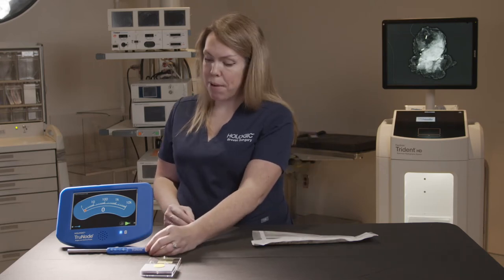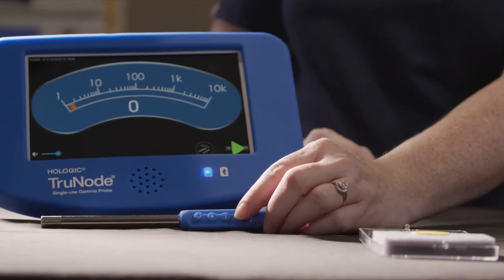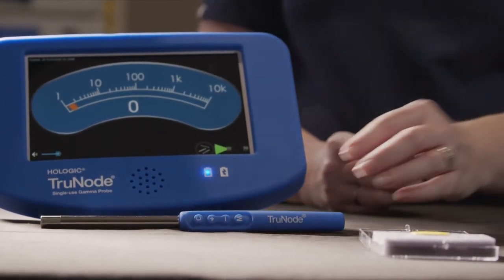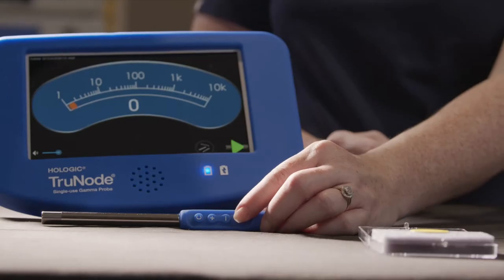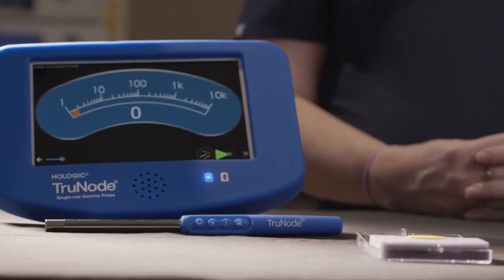Let's start with the M button, which stands for mode. A short press of the M button is actually going to toggle our probe between scan mode and point mode. The collimator of our probe is actually built internally into the probe, so by hitting the M button we're able to open the collimator up for scan mode, or for point mode we're able to narrow the collimator's focus.